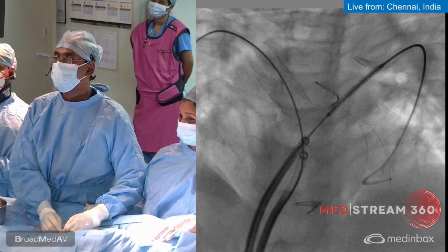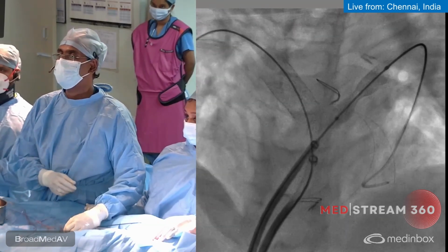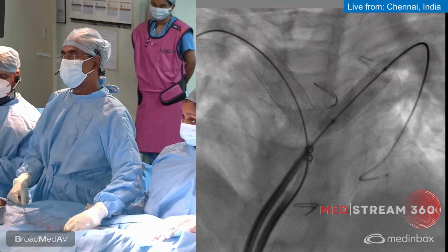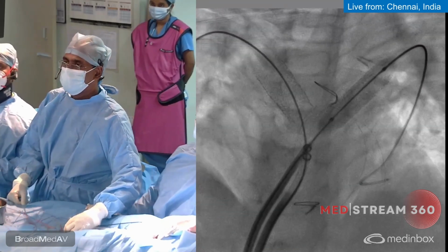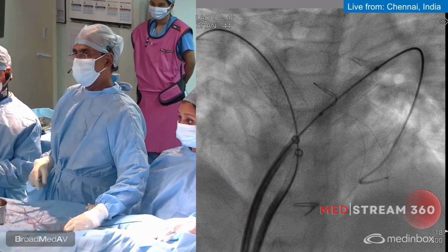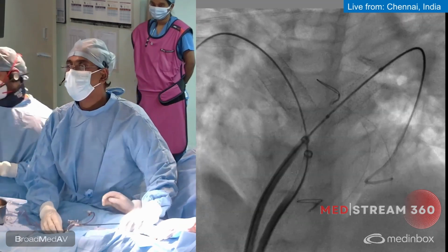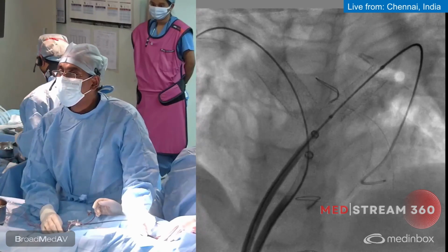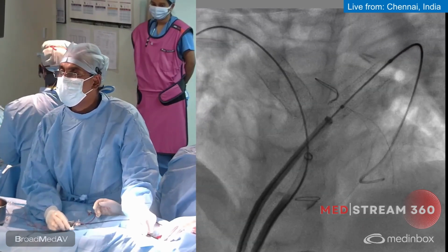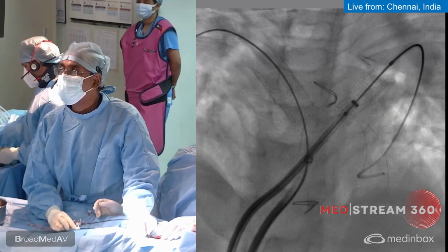Yes, sir. Keep going. Okay, I'm inflating. Yeah, just go rotation. Go to 10 or 12 atmospheres. 10 atmospheres now. 11, 12. Okay, now deflate. Since we have decided to post dilate this, let's get a 12 by 2 Mustang ready. It's fully deflated.